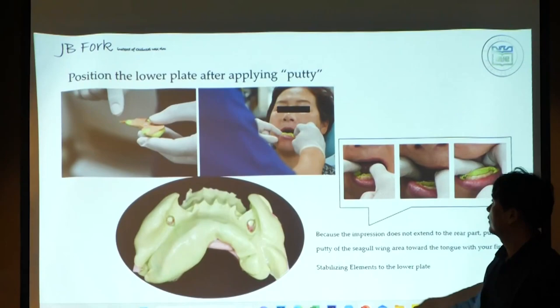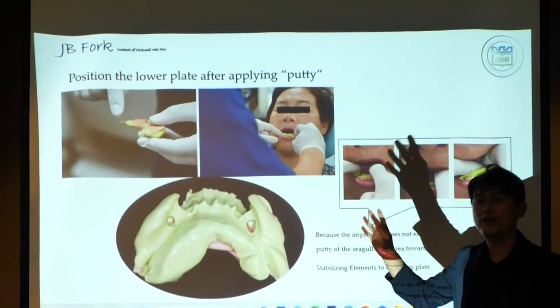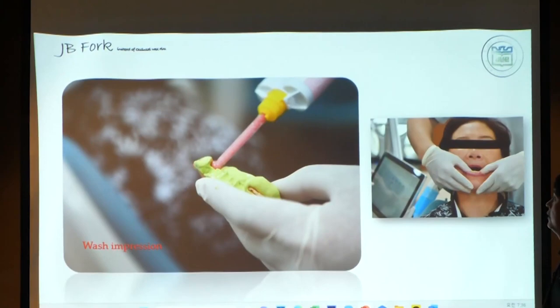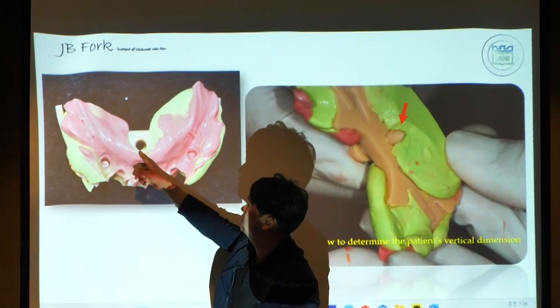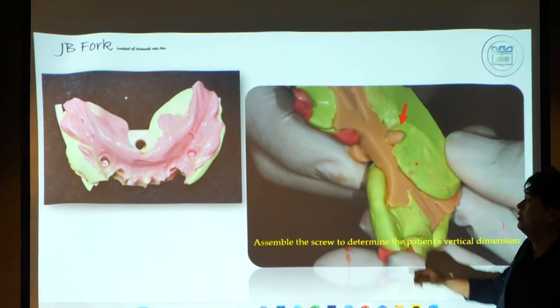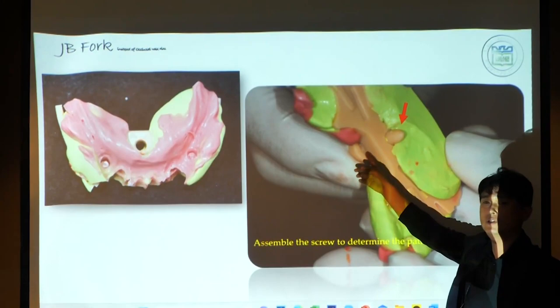In this case, the patient has anterior teeth, so there are so many merging points. Do you understand? So after the bite taking, insert the silicone bite, and then put it one more time. And then I removed the whole covering silicone material with the knife, very simply. And then I connect this screw pin. And then I put the upper jaw and lower jaw plate and bite together. And then I adjusted the height, rotating this screw pin. Do you understand?